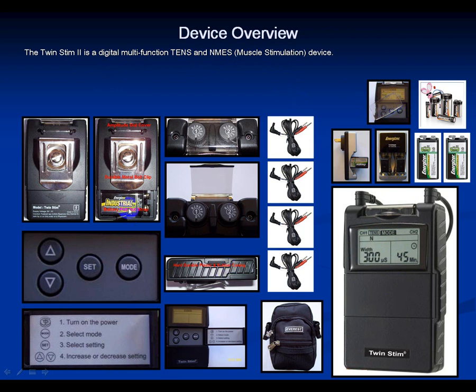This device runs off a 9-volt battery. We provide the highest quality Energizer rechargeable batteries with a dual Energizer battery charger. It's a two-channel device with channel 1 and channel 2, each with a lead wire, and a backup set is included. These are the amplitude or intensity dials, with a safety cover to prevent bumping the dials during treatment. Opening the front reveals the programming command center below the screen with a menu of button functions.